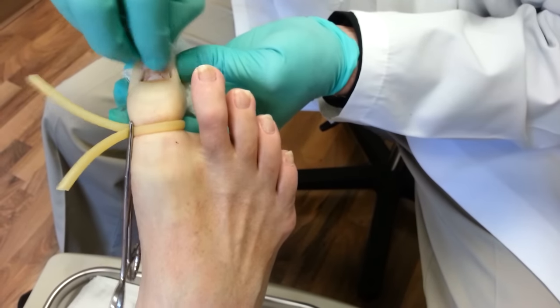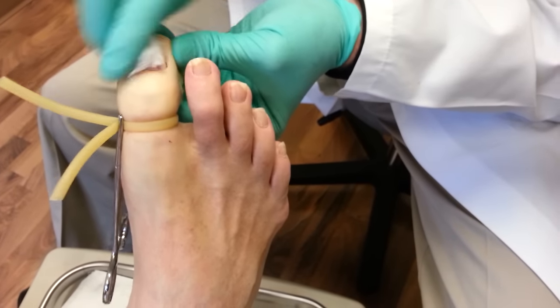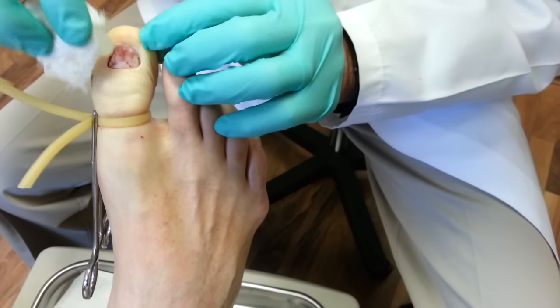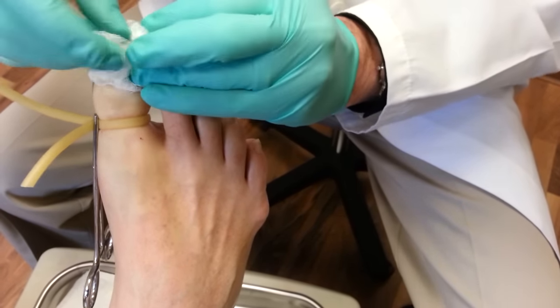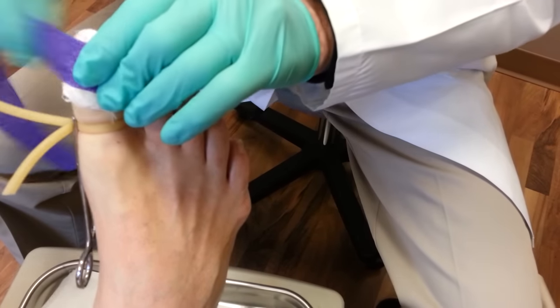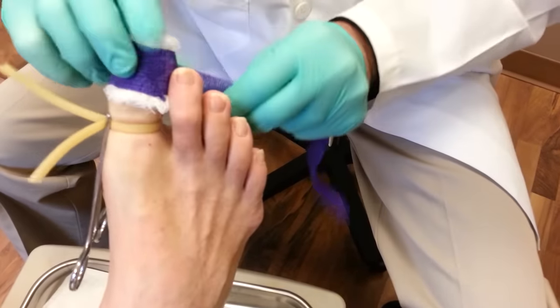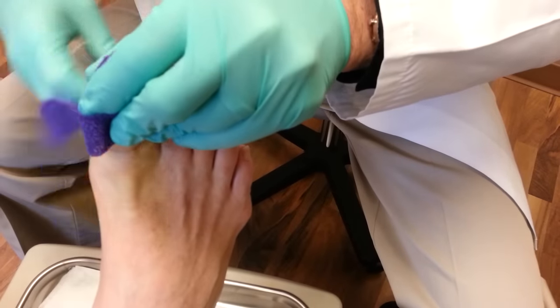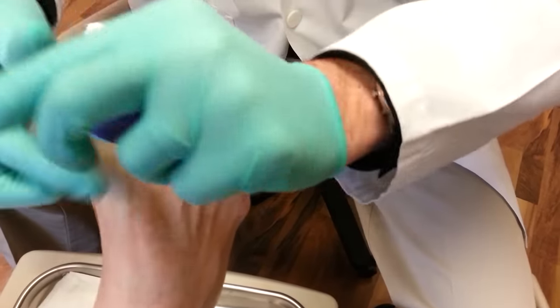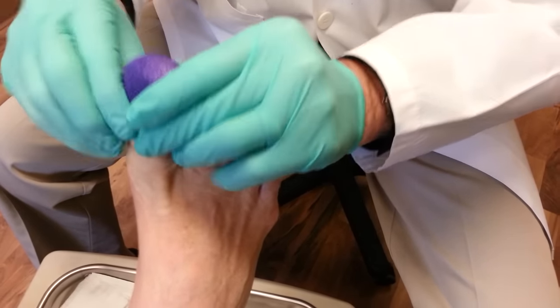And then we flush this out with alcohol, and then we just put a little antibiotic ointment on here and some gauze, wrap it up and take off the tourniquet, and you're all done.